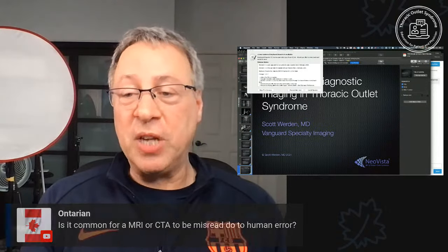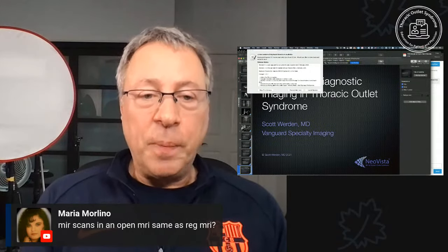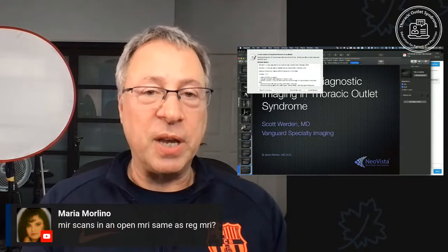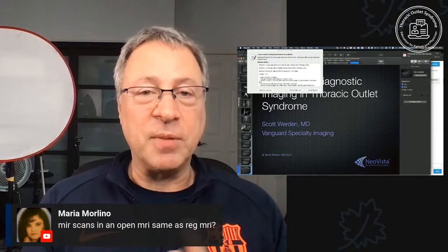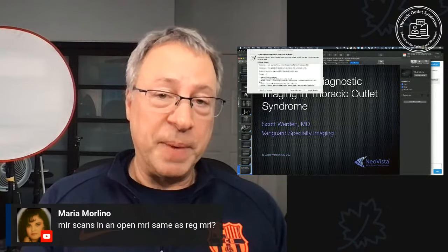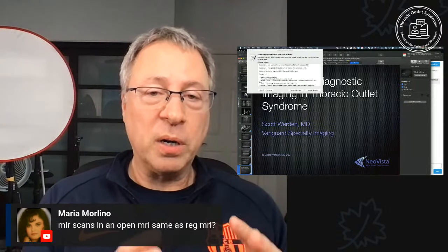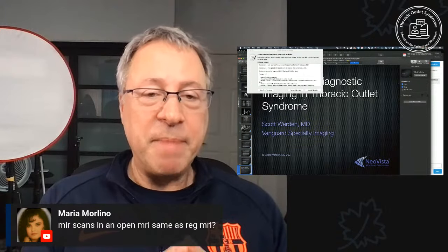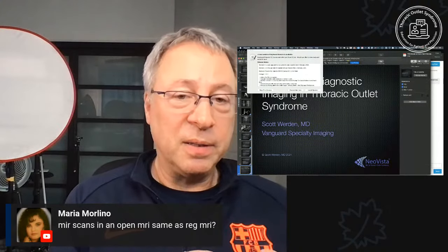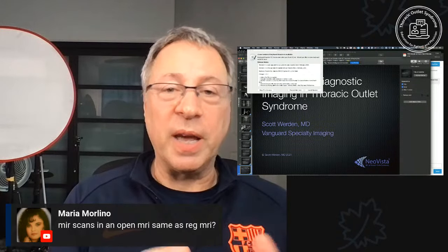Is open MRI the same as regular MRI? Thank you for the question, Maria. An open MRI is meant for patients who don't feel comfortable in the tube of the MRI scanner. I've had MRIs myself, and sometimes I've been comfortable and sometimes I've been a little bit edgy about it. So the open MRI feels better. But the open MRIs are by necessity of a lower strength of magnet. Now, the main magnet that we use for an MRI determines how much resolution we can get. In other words, like a magnifying glass, how close can we get? How small a structure can we see?